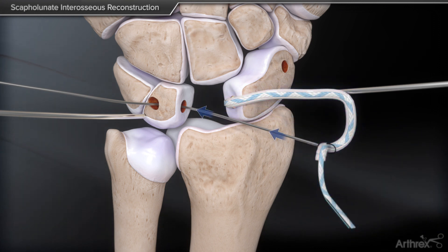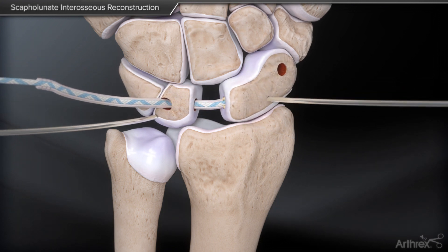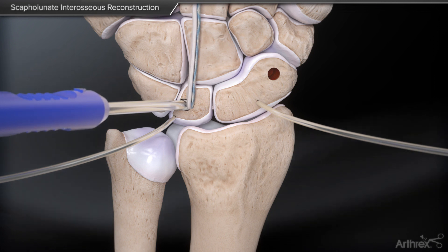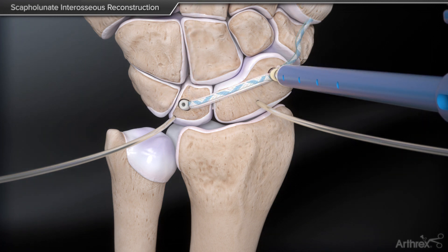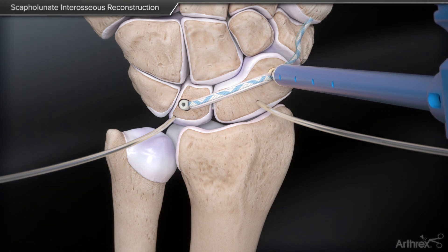Next, the tendon suture construct is passed through the lunate tunnel, the bones reduced, and the construct secured dorsally with the tenodesis screw. The final DX swivel lock is placed in the distal pole of the scaphoid to control scaphoid flexion and complete the procedure.